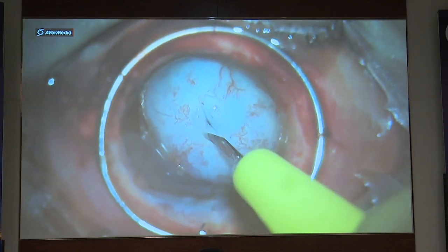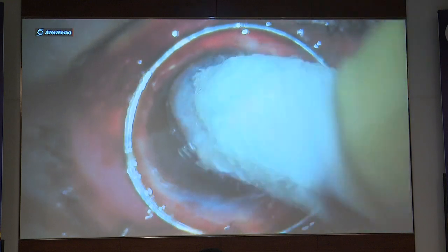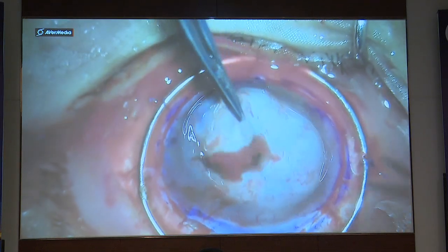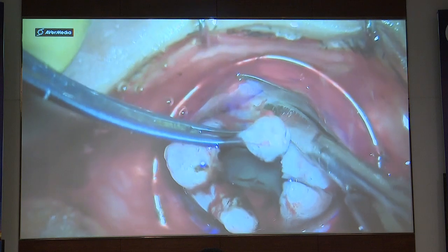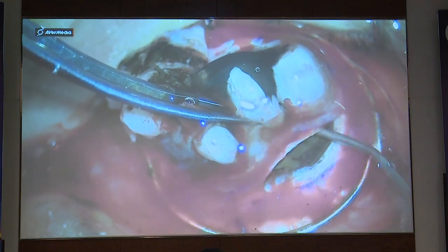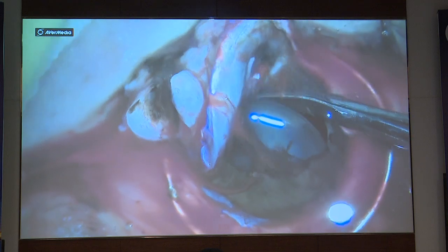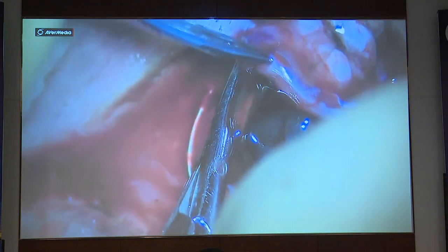The staphyloma was too big, so trephination was not possible. So first I deflated the staphyloma, and then trephination was easily done. Here a 13.5 mm trephination was done. The cornea was then cut into quadrants. Inferiorly, the iris was totally plastered to the cornea. Superiorly, the rest of the iris was separated and careful dissection done not to cause further trauma to the iris. Lens was subluxated for more than 180 degrees.